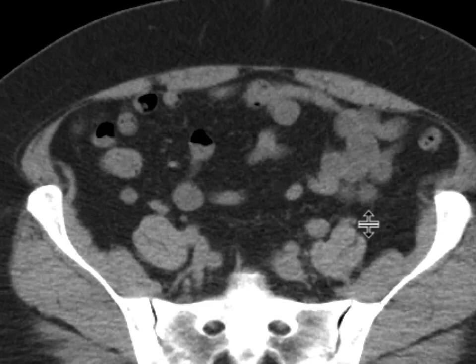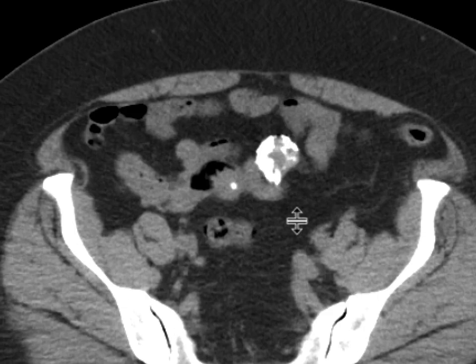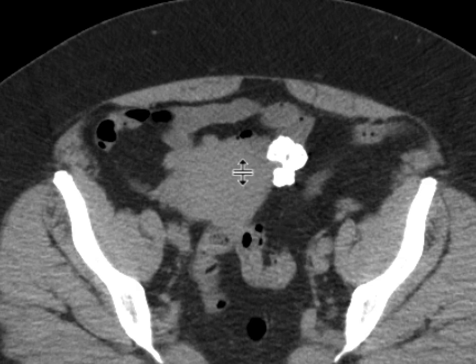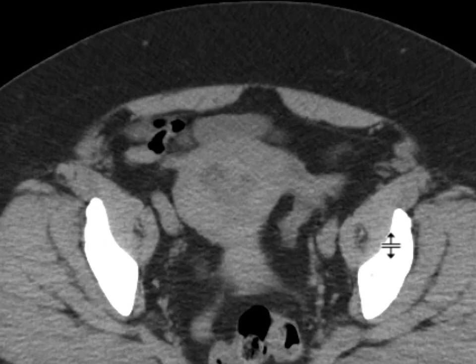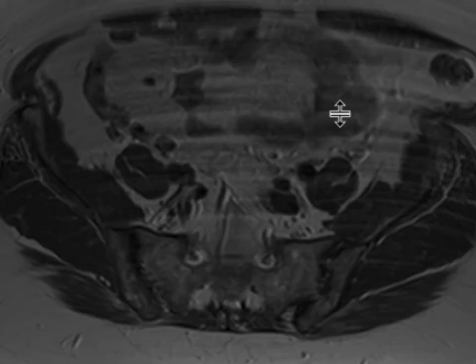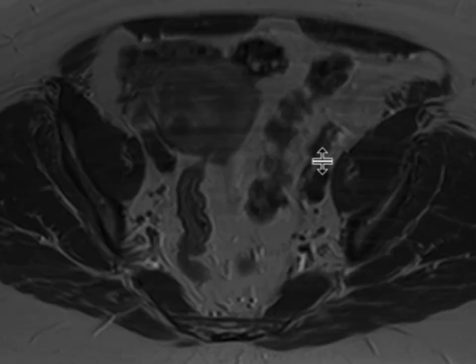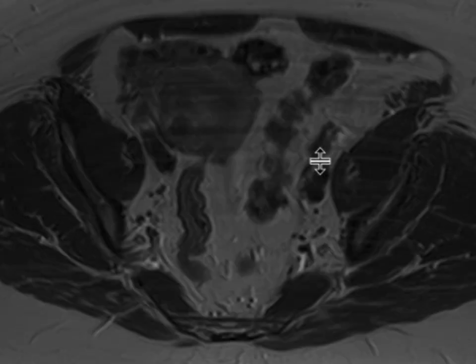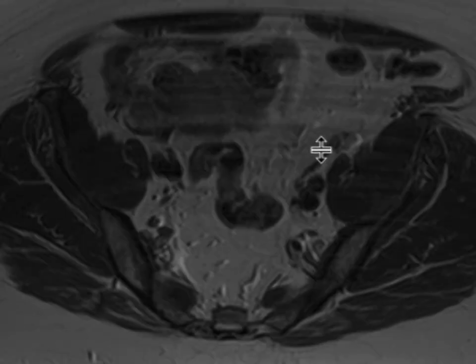This one looks like it's associated or intimately associated with some loops of bowel, but it's also intimately associated with the left adnexa and the uterus. An MRI was suggested to further evaluate these findings. Now, on the MR, at least for the mass in the midline, we can see that it's T2 hypointense, and it really does look like it's associated with the left uterine fundus — so that's going to be a subserosal fibroid arising in that location.